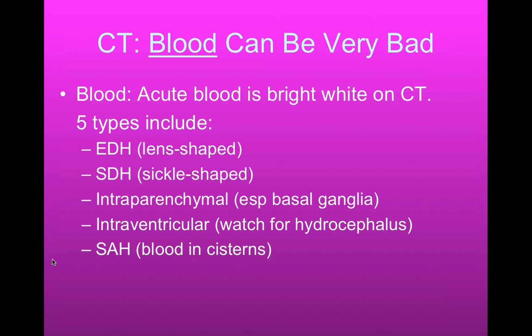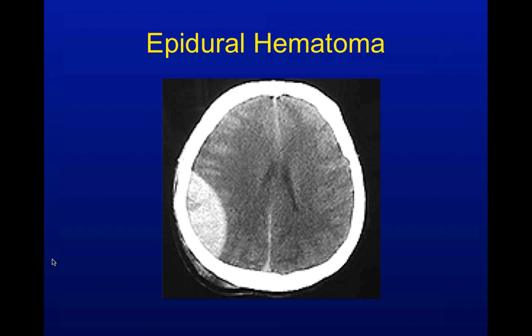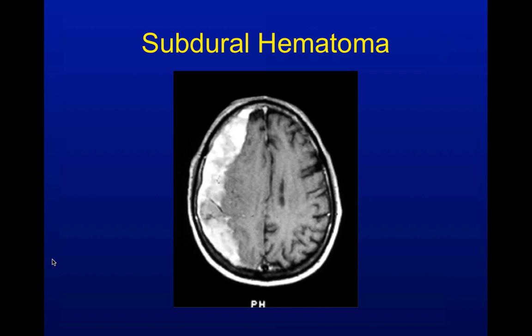We'll go through lots of images here. For that first piece — blood — we're going to look for epidural hematomas, subdural hematomas, intraparenchymal bleeds, intraventricular bleeds, as well as subarachnoid hemorrhages. So we have a beautiful lens-shaped hematoma here — this is an epidural hematoma. Maybe a little hint of mass effect; the ventricles are a little collapsed over here on this side. Epidural hematoma with a little bit of midline shift.